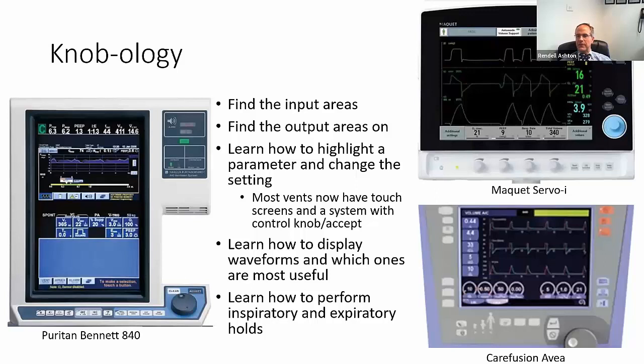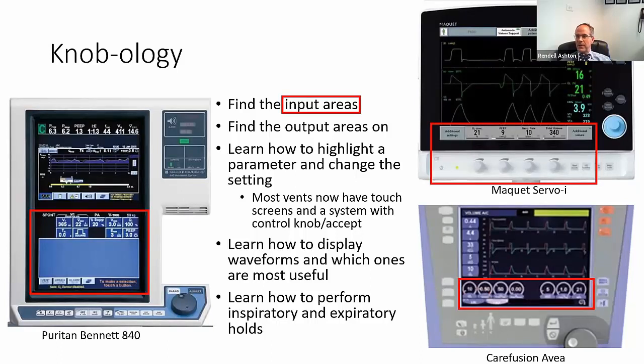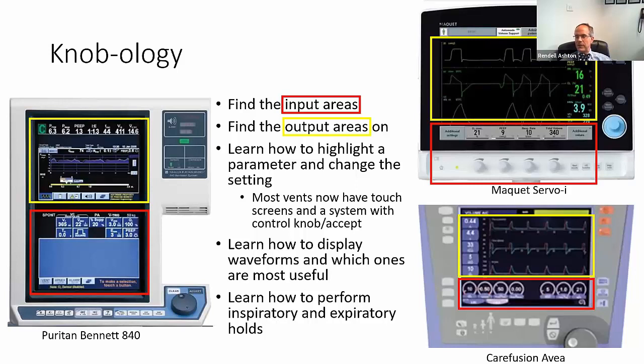The first thing I do when I'm looking at a ventilator, and I've got 3 different common vent displays here, there are certainly many others, is I figure out where the input areas are. What part of the display represents the settings that I have put into the machine or somebody else has put into the machine that are parameters that I want? And then as opposed to that, what areas are output areas? So that will always include the waveforms that you're seeing, which are going to be pressure, flow, and volume, or maybe 1 or 2 of those. And then whatever numbers reflect the interaction between the ventilator and the patient. So you have a set respiratory rate, for example, down here, and then you would have an actual respiratory rate up here in the output area.